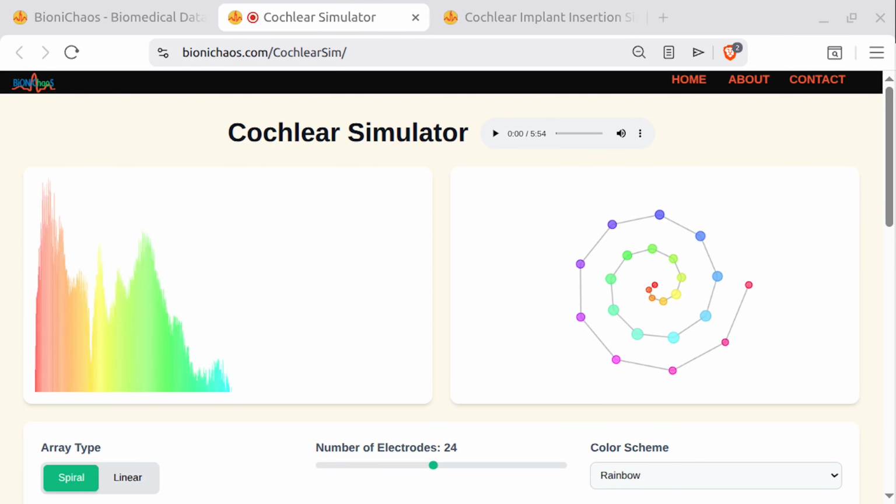Thank you. But what about the permanent chronic burdens that aren't fatal, but deeply degrade the lived experience? We celebrate the restoration of hearing, but we rarely talk to the patient about what is being permanently sacrificed to get it. Sacrificed? I think that's a strong word. Is it? Approximately 10% of these patients will experience chronic pain or discomfort at the implant site for the rest of their lives. 10%. Well, chronic discomfort can mean a lot of things.